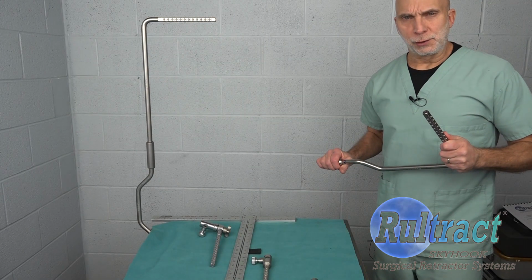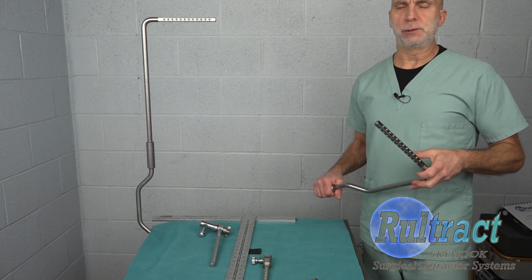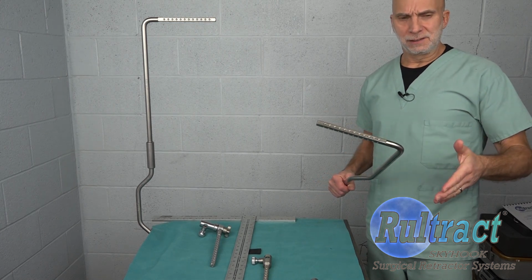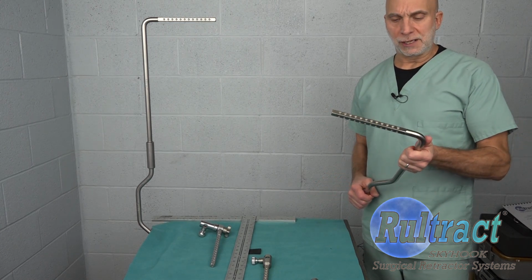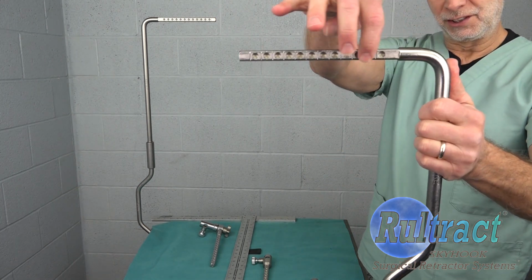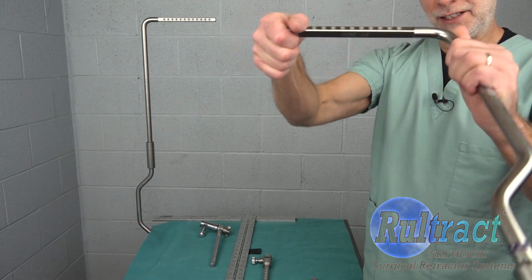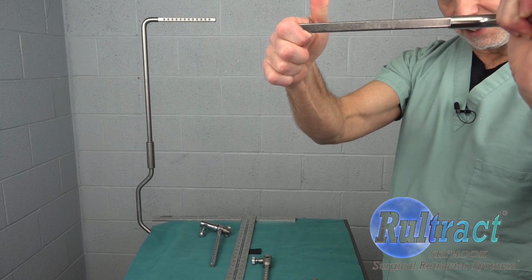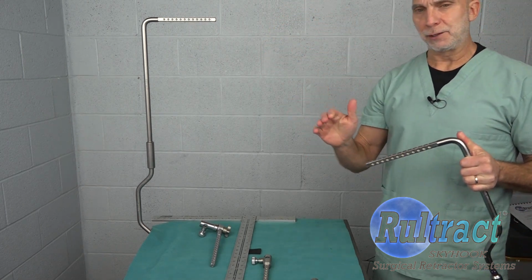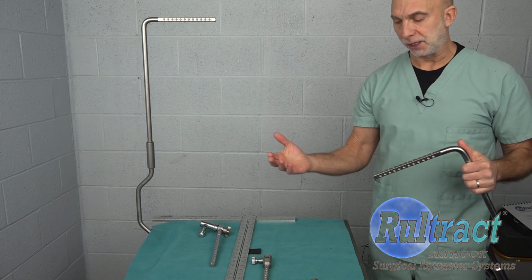The first thing to take note of is that hospitals that have the generation Rultract from the mid to late 90s to early 2000s are going to have a top post that has detents. These are called detents on the top and the two sides, but will not have the detents on the bottom. And that matters because of the way that we're going to set the extender bars up.